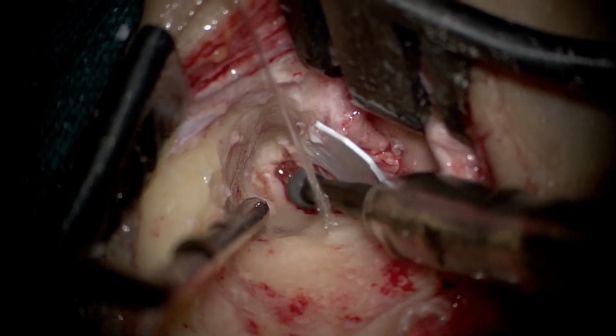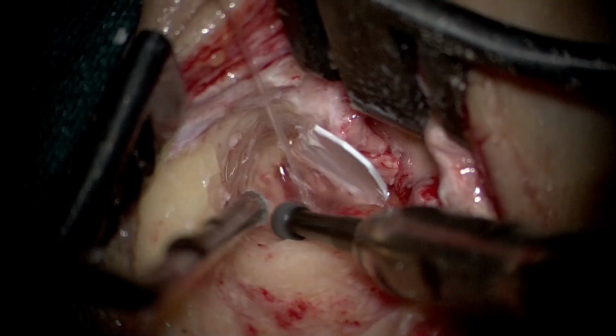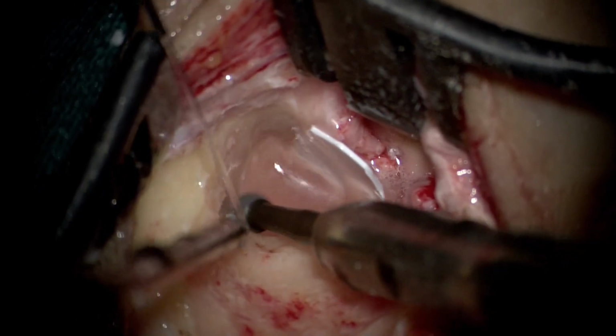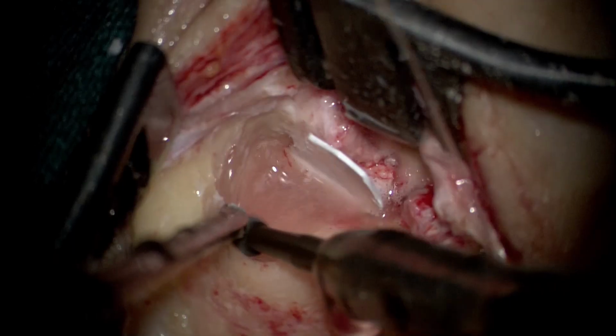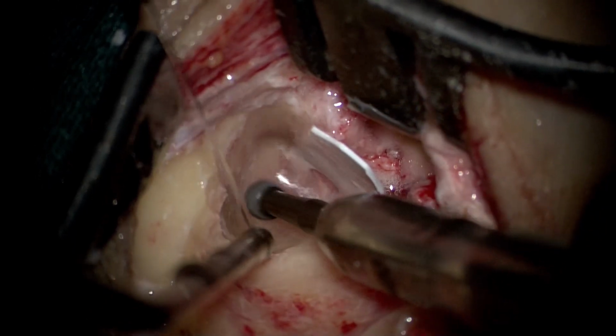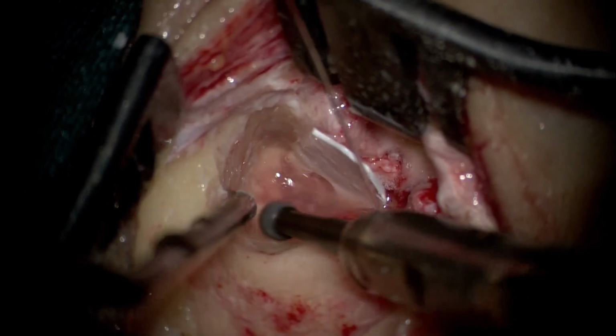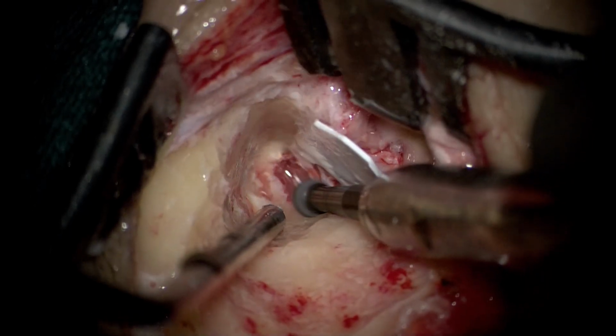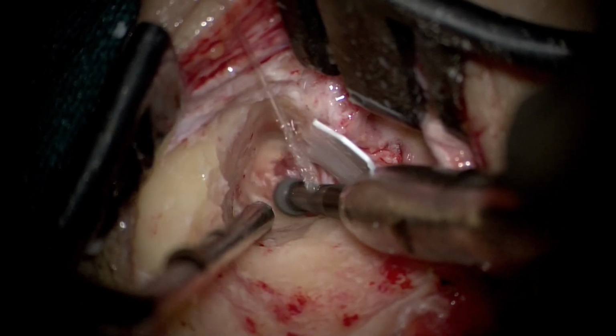So a relatively small to medium-sized cutting burr is used for the initial steps. Our goal here is not to create a very big cavity. So we are limiting the drilling initially medially to see what are the limits of the cholesteatoma. And thus we would keep on enlarging this cavity on a need-based situation.